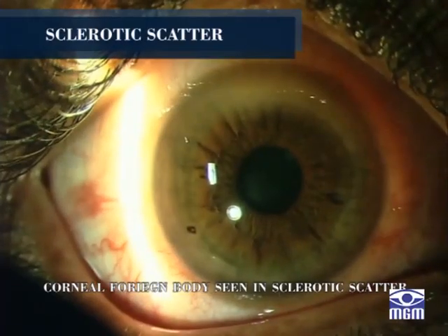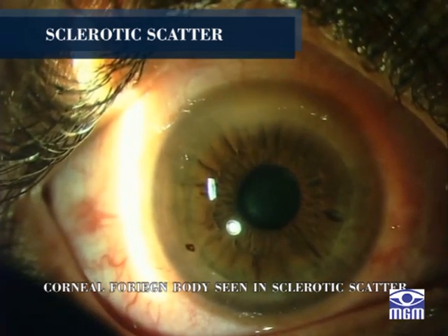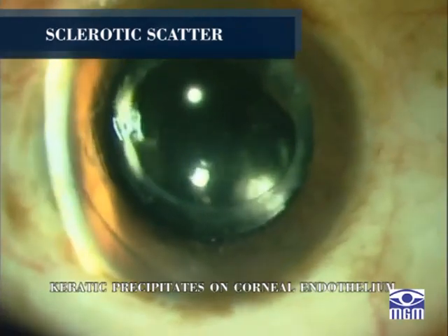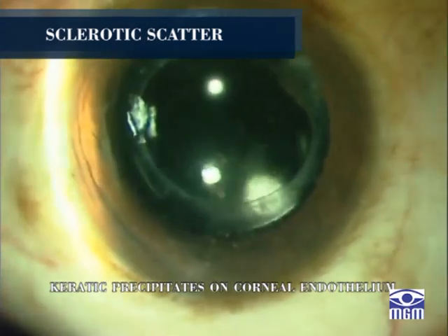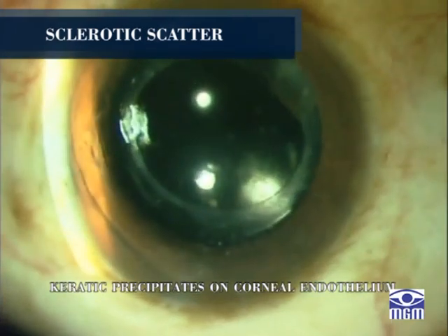In the abnormal cornea, the light that is axially reflected or refracted makes the abnormality visible. The degree to which this light is visible depends on the optical density and other characteristics of the abnormality and the size and intensity of the incident light beam.